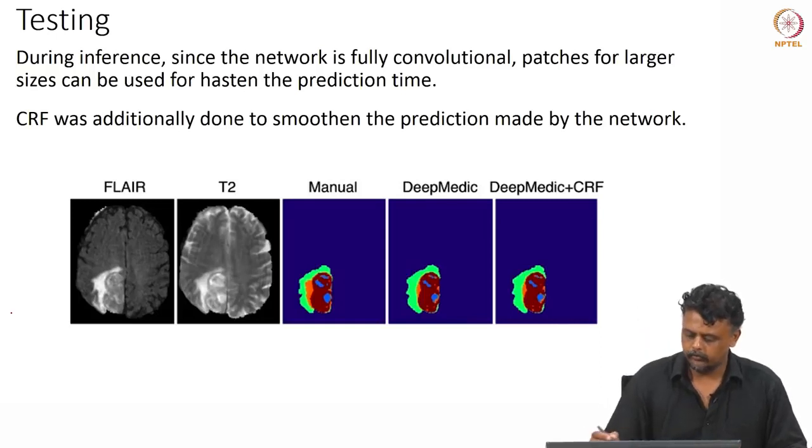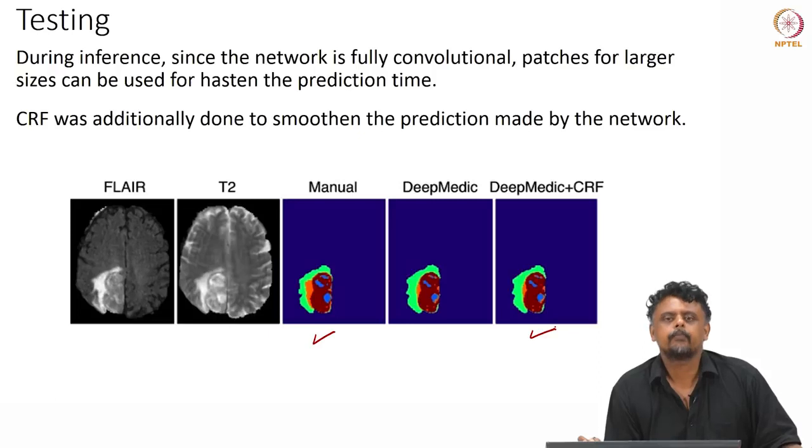So, if you look at what you have seen, these images show the manual ground truth and this is the net output predicted by the network. Okay. So, the CRF is used to regularize your output predictions. So, that is one of the other novelties in this particular submission.